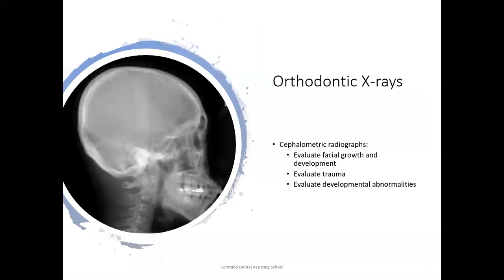This is an example of the cephalometric x-ray. So you can see it's just either the right or the left side that we've taken, and it's going to be that profile of the patient.